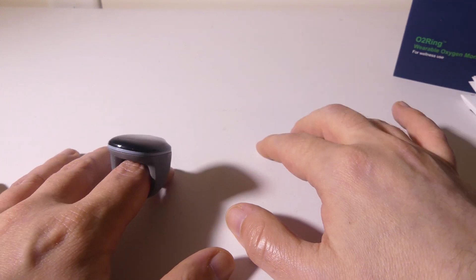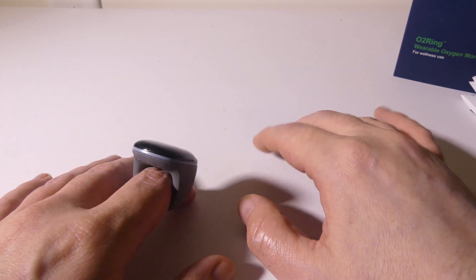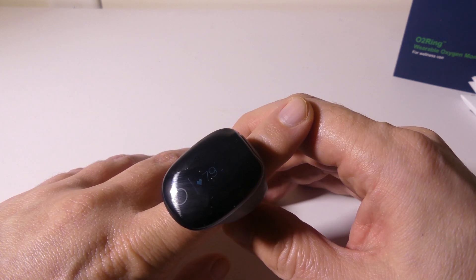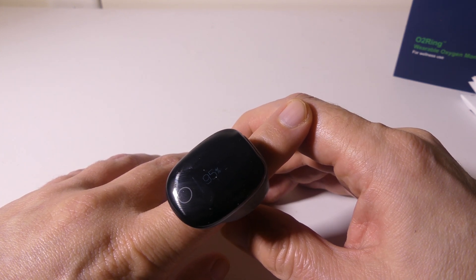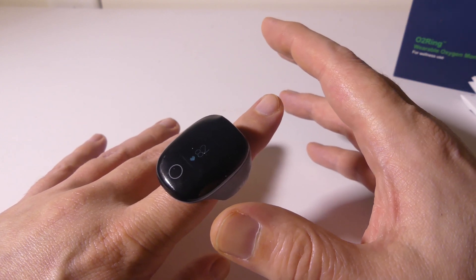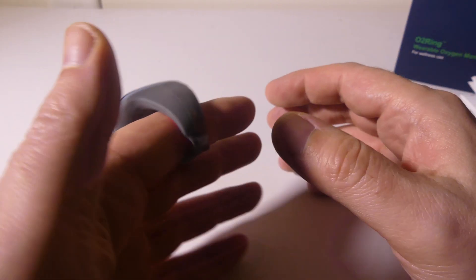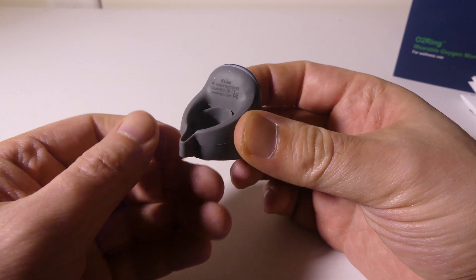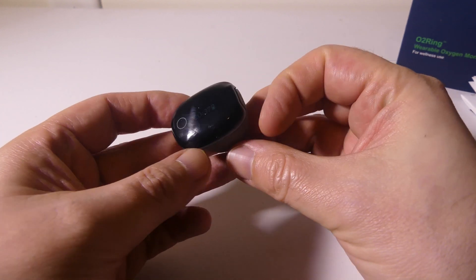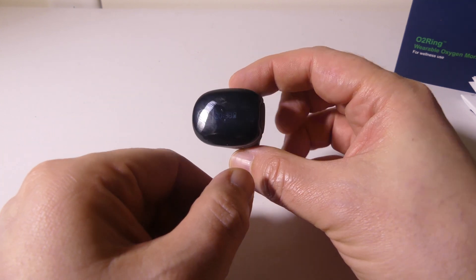It leaves the tip of my finger open, so if I need to be typing or doing something else, it doesn't cover the fingertip — that's actually pretty nice for longer monitoring periods during the day. It only weighs 0.53 ounces, or 15 grams, so it's super light on your finger.